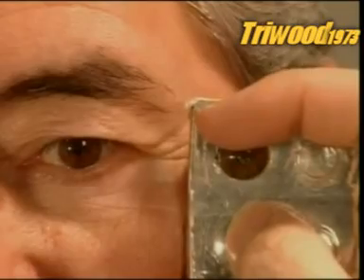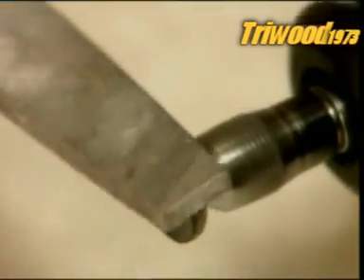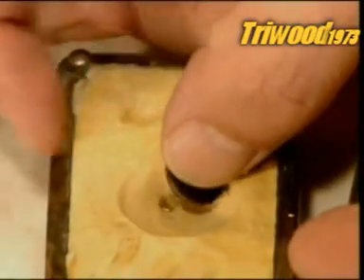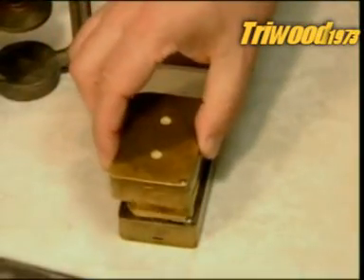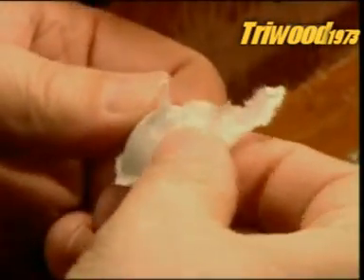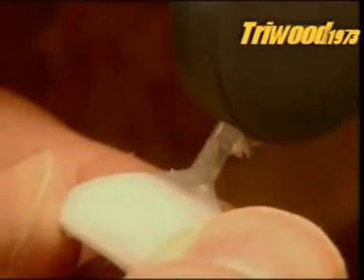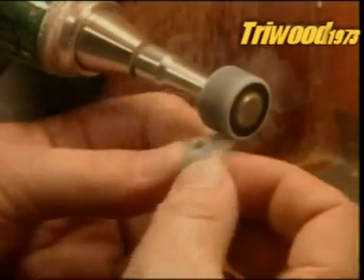At this point, the artificial iris is 13mm in diameter. If the patient's real iris is smaller, they trim down the replica to match. The iris then goes into the plaster mould, covered with white acrylic dough. After the same high-pressure curing process as before, out comes the artificial eye, covered with excess white acrylic. They trim off that excess and the peg using a grinding tool and a cutter.